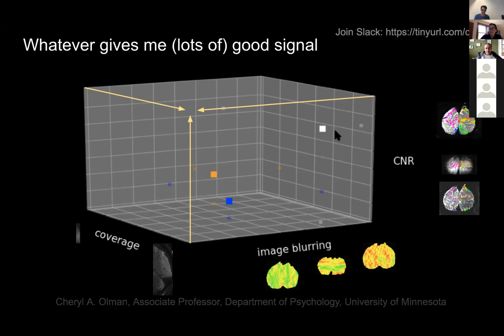So I'll wrap now with a return to this coordinate system for the protocol I was developing. I ended up picking gradient echo because I wanted a lot of voxels to work with and easy coverage, and I was willing to sacrifice some spatial specificity. Having picked gradient echo, that leaves me with the problem of figuring out what to do about big veins.